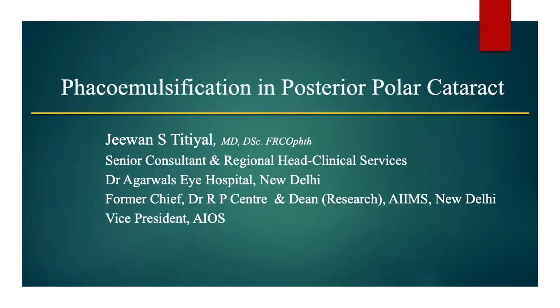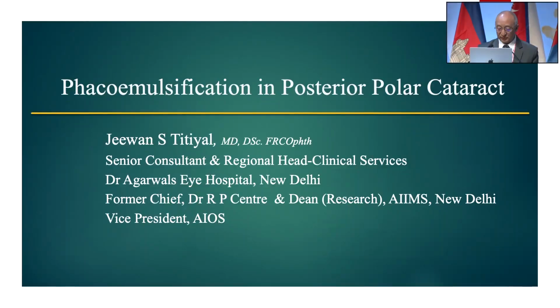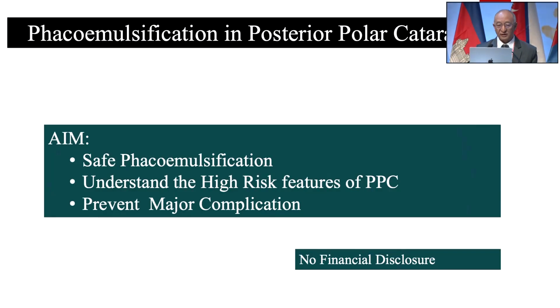Good morning, friends. Thank you, Professor Maipal, for giving this opportunity in the instruction course. I'll be talking on posterior polar cataract management. You all understand the basic aim in any cataract surgery, including posterior polar, is to have a safe surgery, that is phacoemulsification. In posterior polar cataracts, understand the very high risk factors which can predispose the case for a PC dehiscence during the surgery and prevent complications which may be associated with these cases. No financial disclosure for this particular talk.